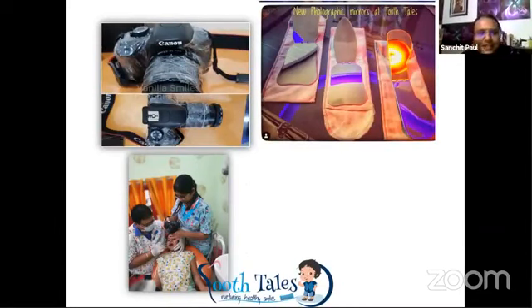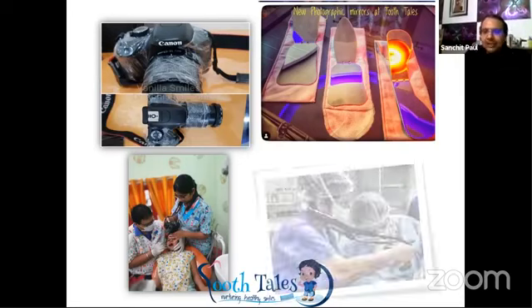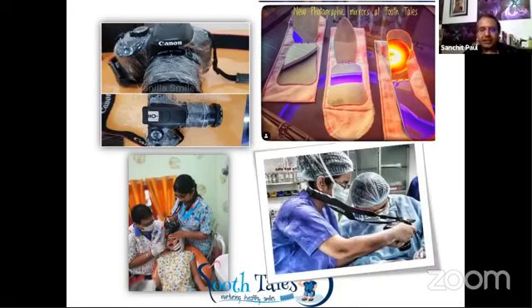But what we highlight is, apart from a good camera, you should have one person who's trained to take good pictures, because not every time with pediatric dentistry would you be able to take all the pictures. So it's important for your staff to be trained, or maybe your colleague or spouse or your associate. And it's also important to have good photographic mirrors, because only good photographic mirrors can reflect back good pictures, which will eventually come in handy in the documentation.